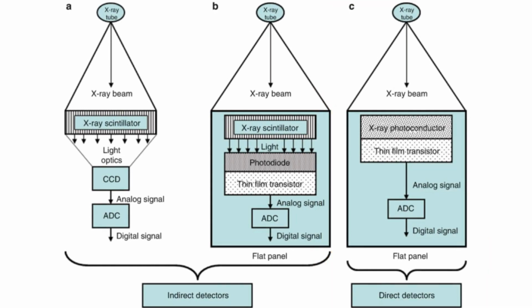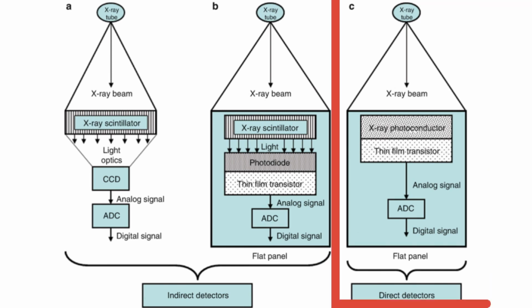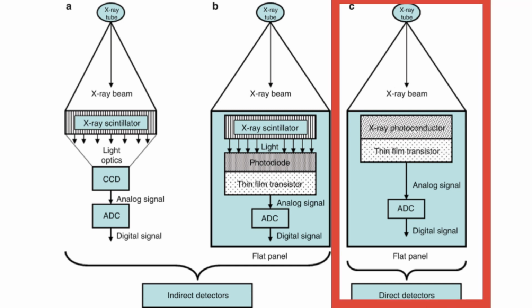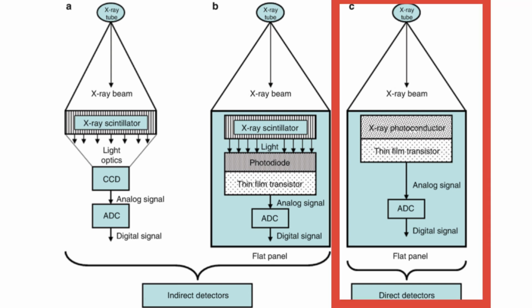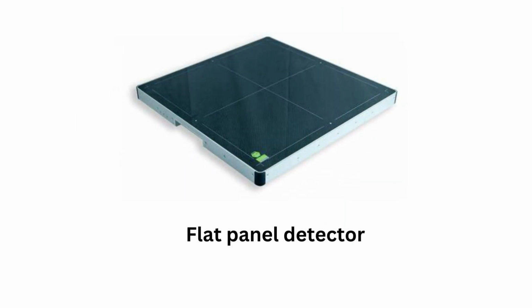These detectors make use of a layer of selenium with a corresponding underlying array of thin film transistors. The principle of converting X-rays into electrical charges is similar to that with the selenium drum, except that the charge pattern is recorded by the TFT array, which accumulates and stores the energy of the electrons. This offers greater clinical usefulness, since the detectors can be mounted on thorax stands and Bucky tables.